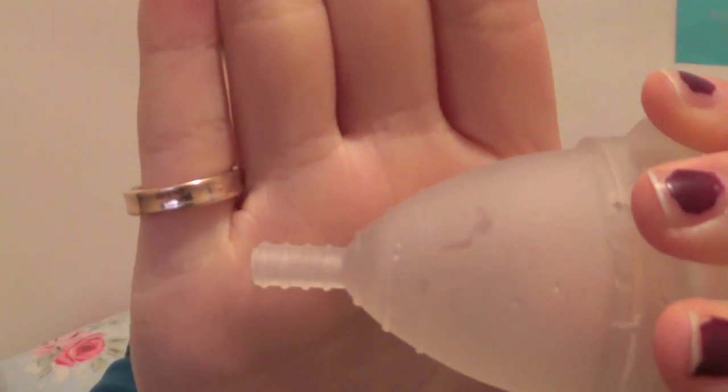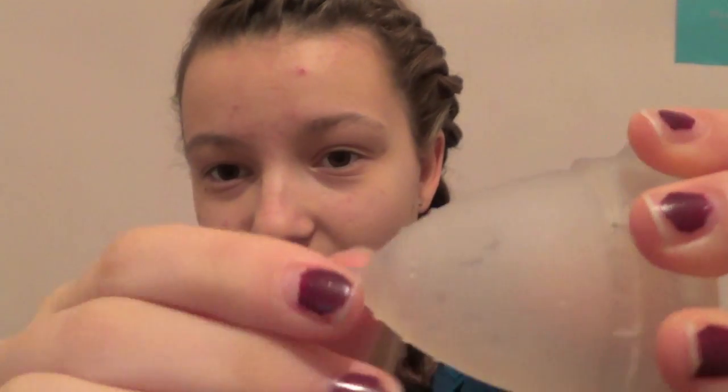For example, it has some pretty awesome grips just here, both on the cup itself and on the stem, which isn't very stretchy. Also, it has a huge rim. Now, I don't usually like to bring this cup out because I don't use it, I don't like it much, but I figured it's time it made an appearance.